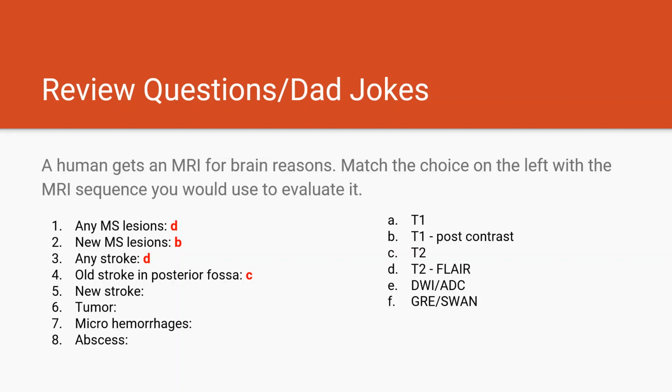Okay, next one. How would you look then for hyperacute or acute strokes? And this one's important to know. Good. It's E. So you have DWI, and then remember that any DWI hyperintensity must have a correlating ADC hypointensity to show that it's just not artificial T2 shine through.